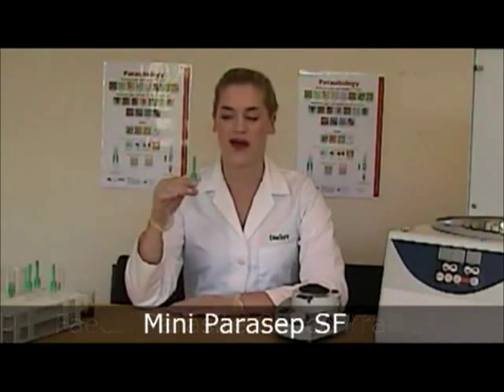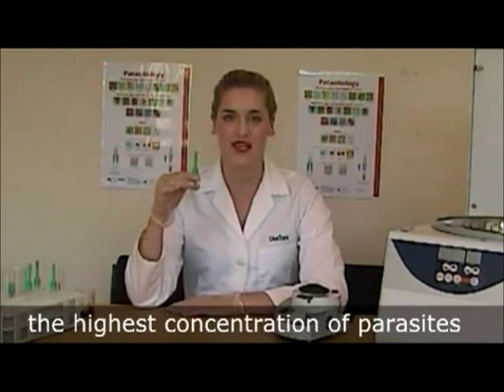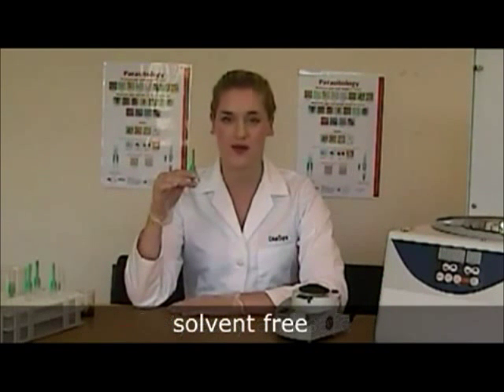I'd like to introduce the Parasep. It's the gold standard in the UK for faecal concentration. The reason most laboratories use the Parasep is because it yields the highest concentration of parasites. It is the fastest, easiest and safest way to concentrate. It is also available solvent free and reagent ready.